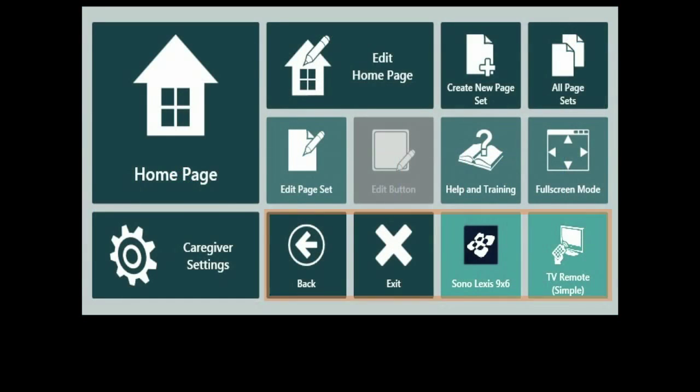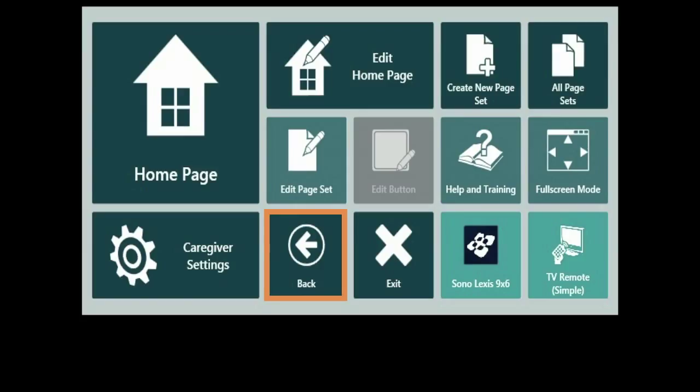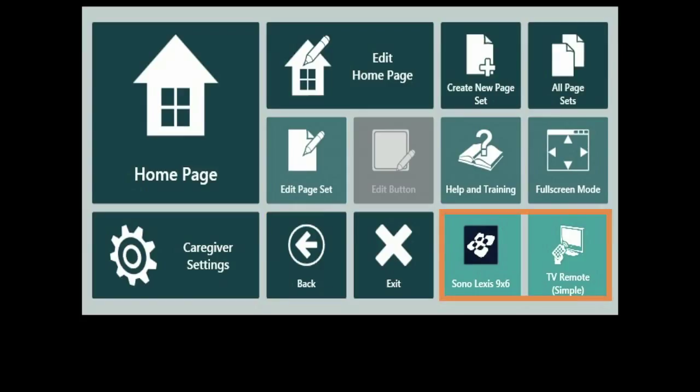These buttons allow you to navigate within and out of your user. Select here to exit Communicator 5. Want to go back to a previous page set? Select here. You also have access to your most recent page sets here.